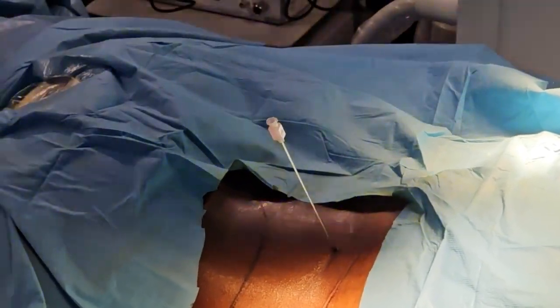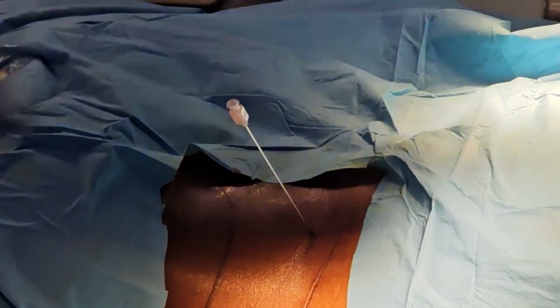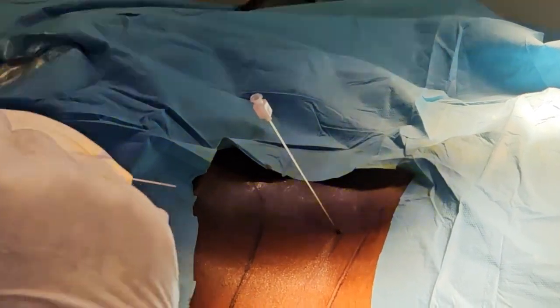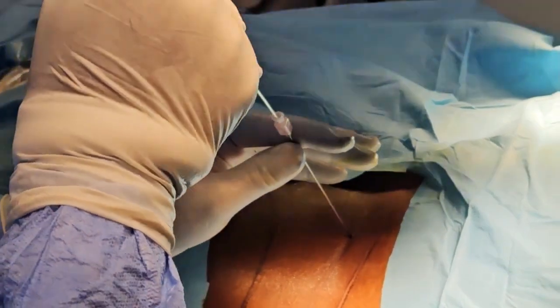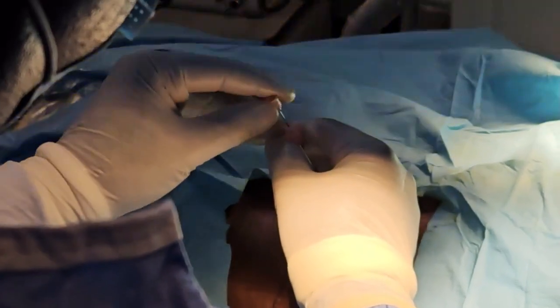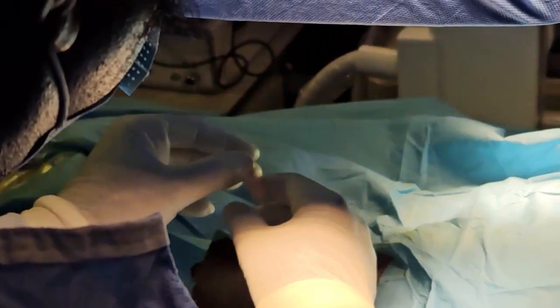Contrast. The needle is there. He's trying to see now if it's there. Now, methylene blue is very good. If you have methylene blue, you can just see the blue fluid coming out of the middle there. If you don't, we use the second plane to get our depth.